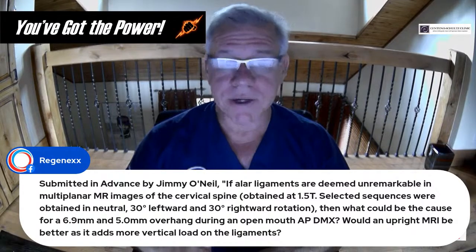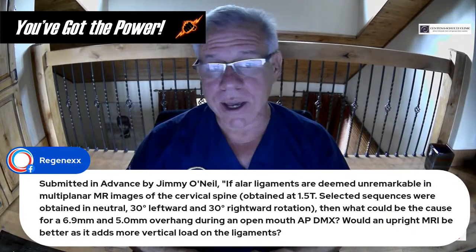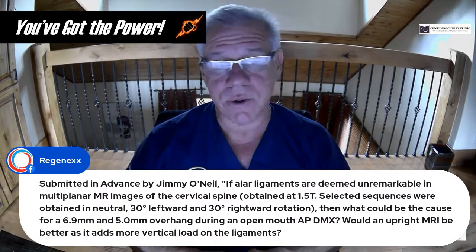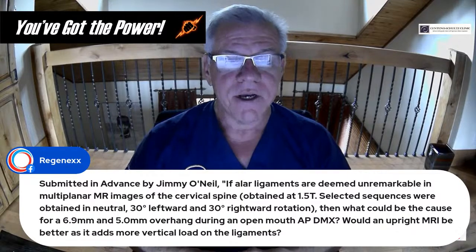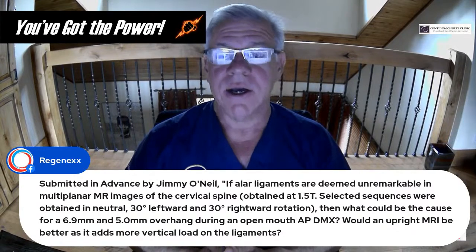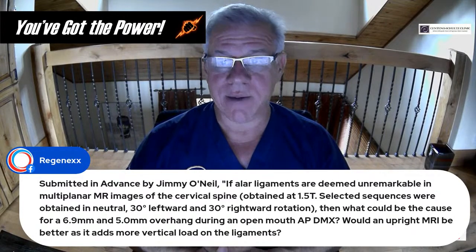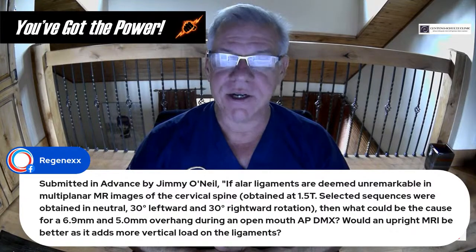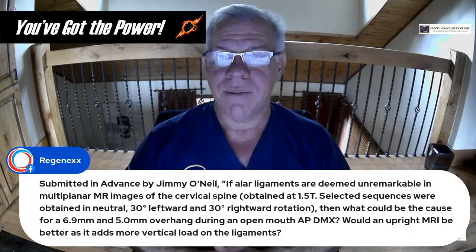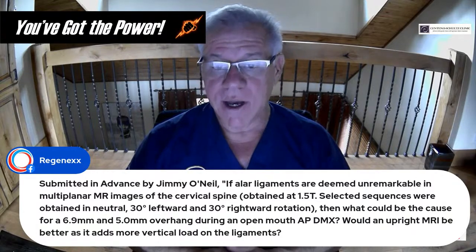Jimmy, I think the problem that you're bringing up is a common one, and that is there's a big difference between structurally looking at a ligament on MRI and actually testing to see if the ligament is doing what it's supposed to on DMX. So even though there can be a correlation between those two, sometimes they're not linked at all. In addition, the question would be, how well did they image those ligaments? They're not easy to image. Most radiologists haven't looked at them more than a couple times in their career. And so I'd have to look at the MRI to see if it's actually normal.